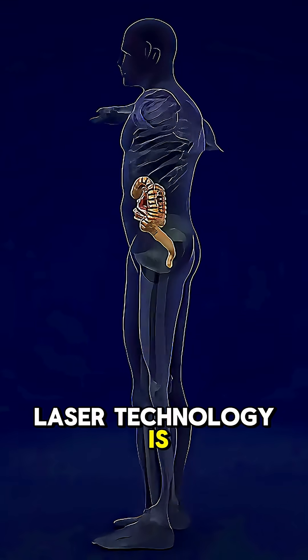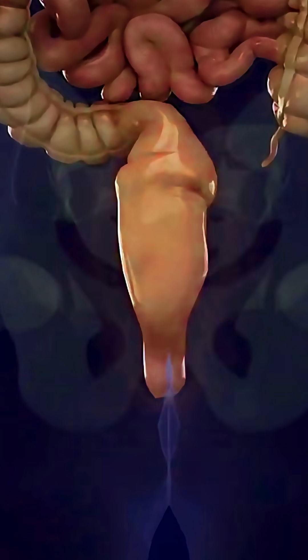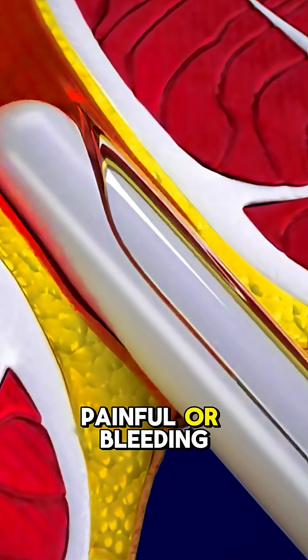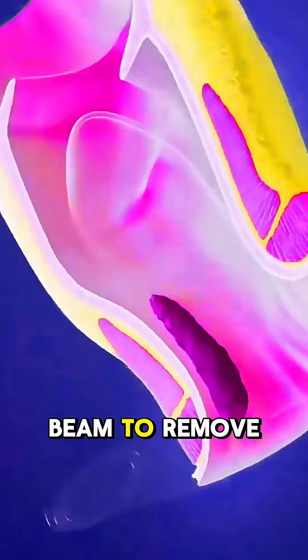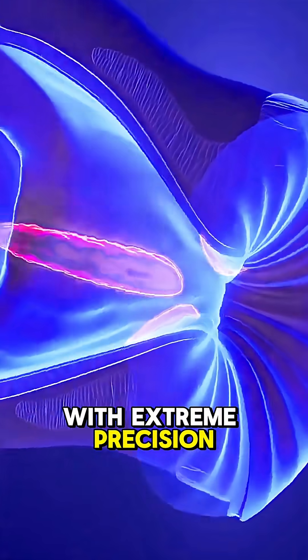Ever wondered how laser technology is used to treat hemorrhoids with less pain and quicker recovery? Laser hemorrhoidectomy is a modern, minimally invasive procedure used to treat painful or bleeding hemorrhoids. Instead of traditional cutting, this method uses a focused laser beam to remove or shrink the swollen hemorrhoidal tissue with extreme precision.